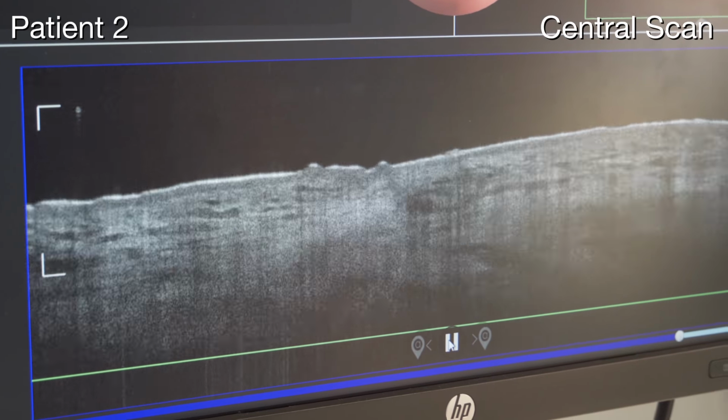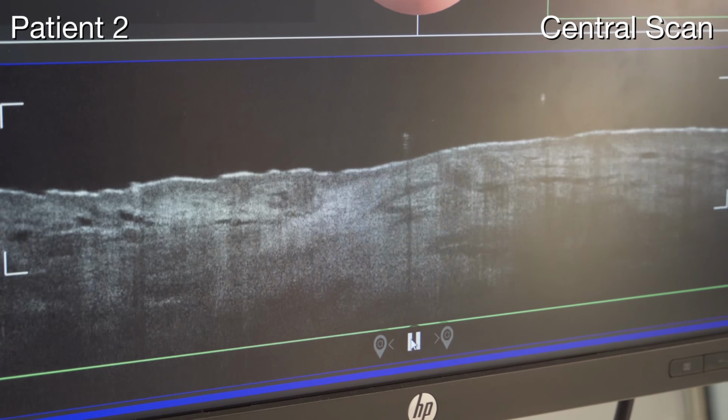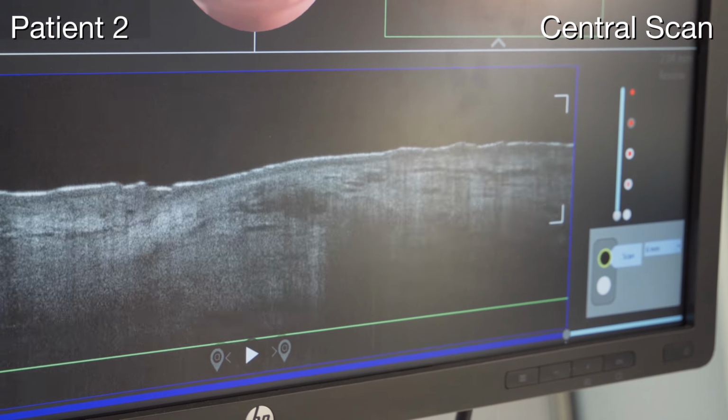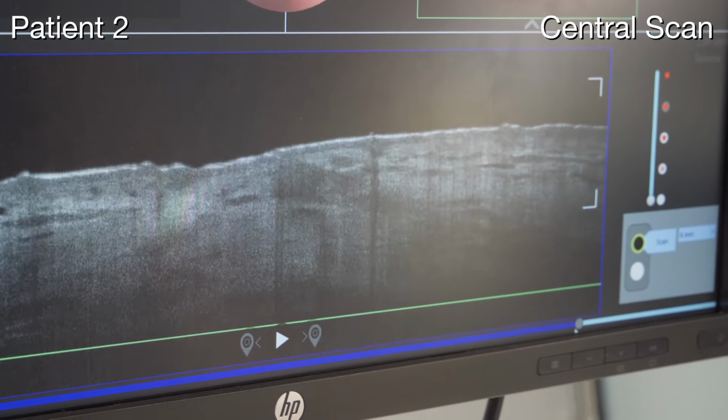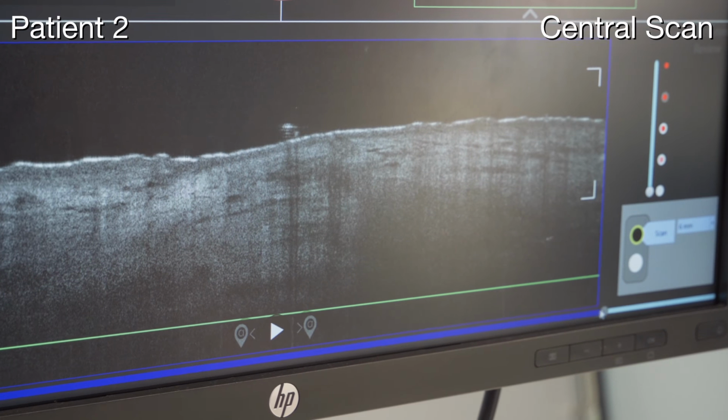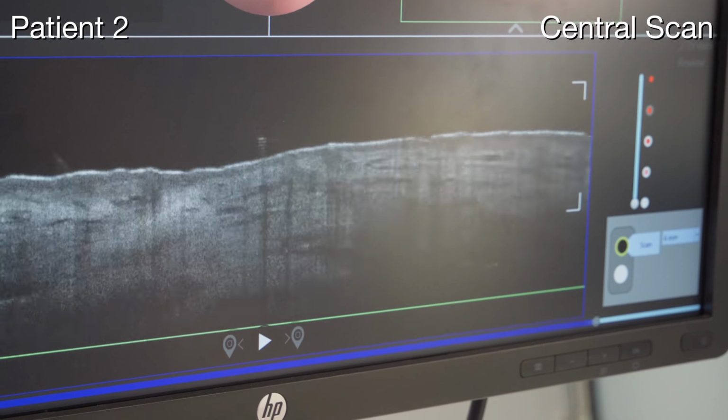So when you press the play button, it just scrolls through all of the images, doesn't it? Yes. Okay. I think there's also something there. And then you can use the slider at the bottom just to drag through. To drag through, yes. Okay.